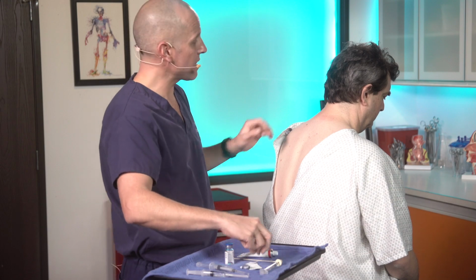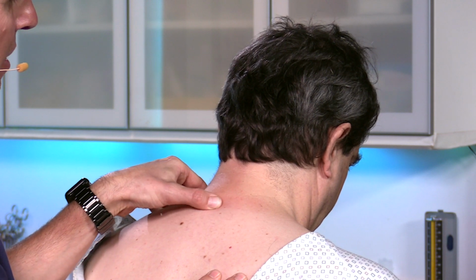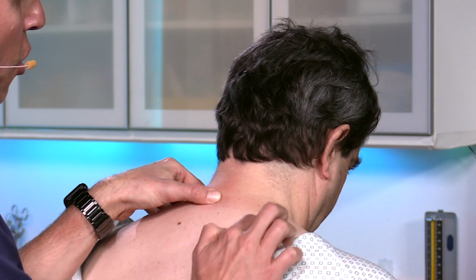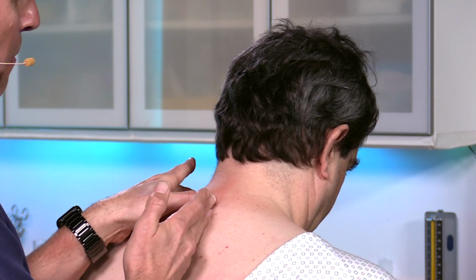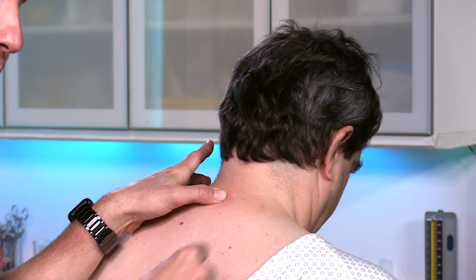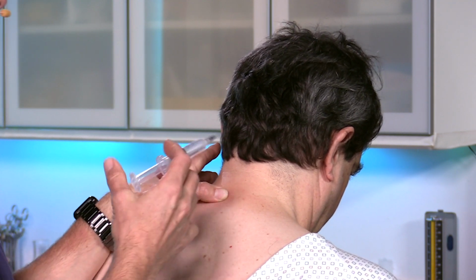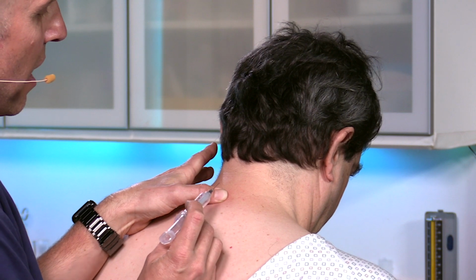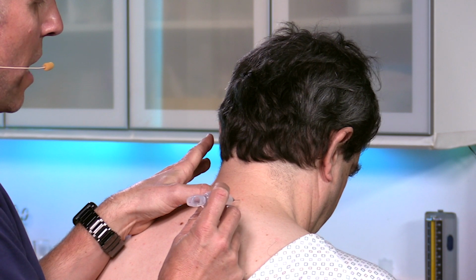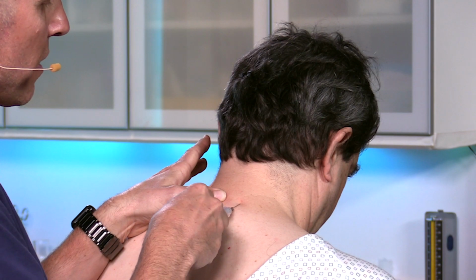For this, I'll do the exact same thing. You're going to find your landmarks. I'll use my thumb, find my C7 posterior spinous process, move up, feel C6. So now I know the area I'm going to be working in. This is my midline. I'll prep that area with my alcohol. And remember when we talked about this, the needle is going to go 2 centimeters lateral to the midline. So 2 centimeters right about in this area here. I'll do my little subcutaneous wheel right there.